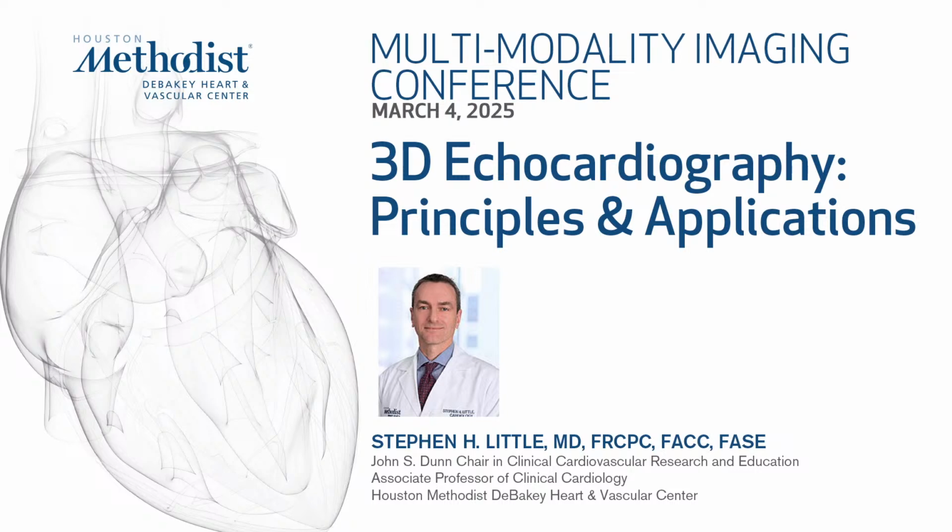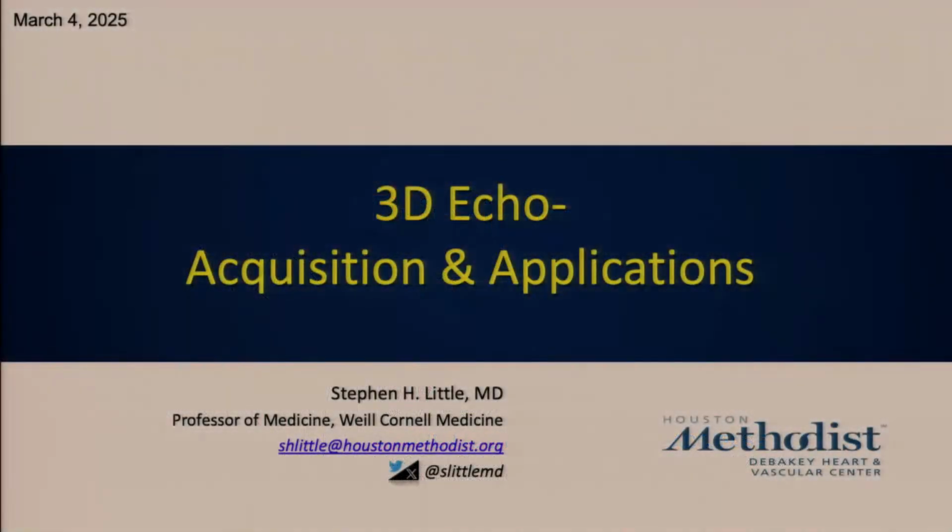It should be inherent to an echo study. So we'll talk about how to integrate 3D echo into the studies, and we'll do that kind of quickly. We'll stop for questions if you have any. And then I'll actually jump into a protocol that we're developing for mitral valve clipping, which I think is a nice example of how we do integration of 3D imaging.